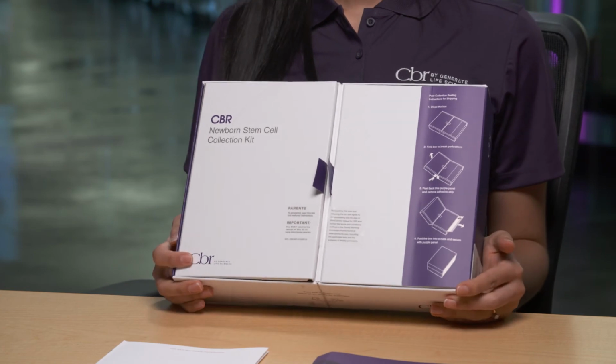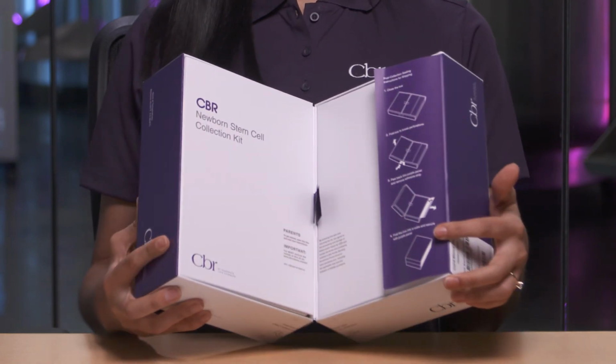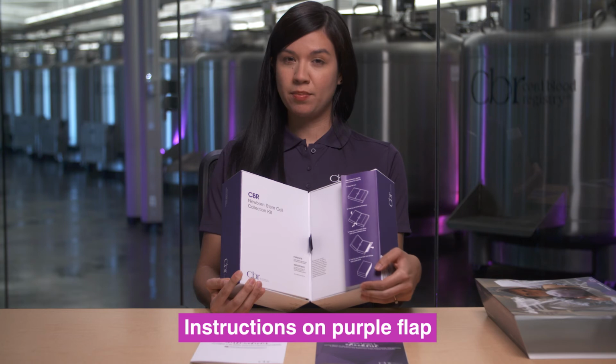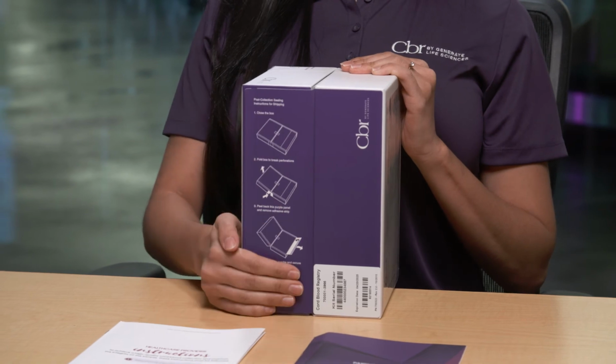As you can see, there are seals on the top of the box and on the bottom. Break both of these seals and close the kit into a cube. The purple flap here is going to allow you to seal the kit properly. Pull the purple flap up and smooth it over like this, forming a perfect cube.